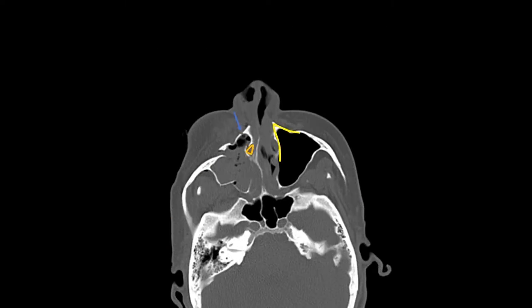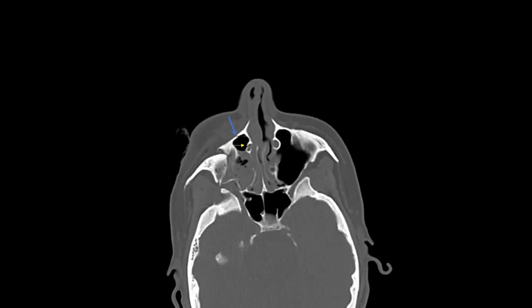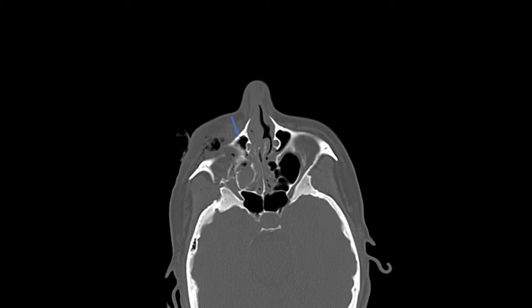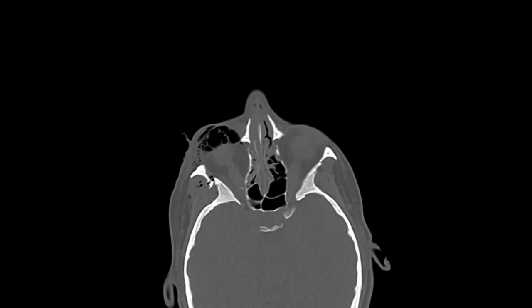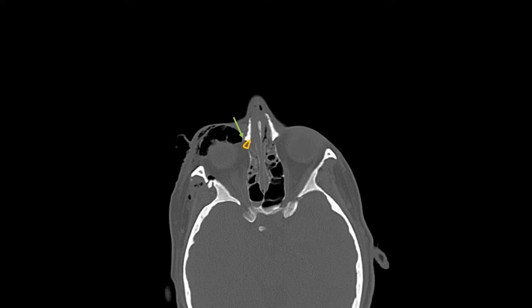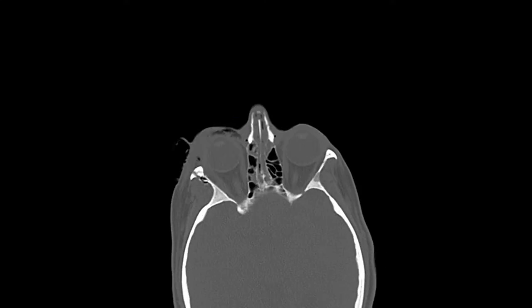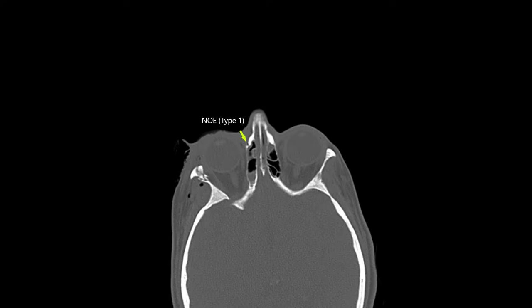Scrolling up higher, the blue arrow marks the medial buttress fracture, while the orange circle marks the lacrimal duct opening and its associated lacrimal bone fracture. The lacrimal bone fracture continues superiorly to the level of the medial canthus. The green arrow shows likely the site where the medial canthus attaches. The medial canthus is attached anterior and posterior to the lacrimal sac and surrounds it. By identifying the lacrimal sac on CT scan, you can see if the bone segment where the medial canthus attaches is also disrupted. The bone where the medial canthus is attached is likely intact with minimal displacement, despite there being a visible fracture.